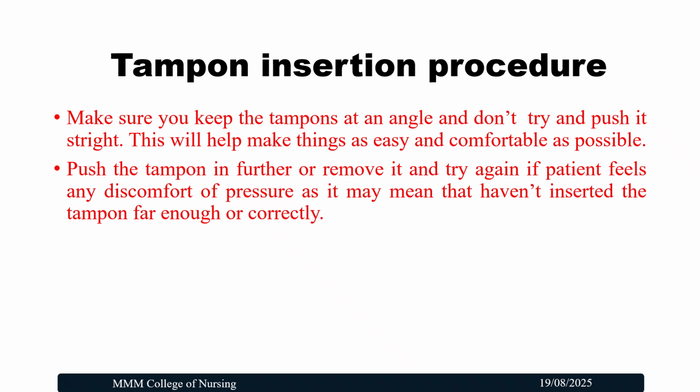Push the tampon further, or remove it and try again, if the patient feels any discomfort or pressure, as it may mean that you haven't inserted the tampon far enough or correctly.